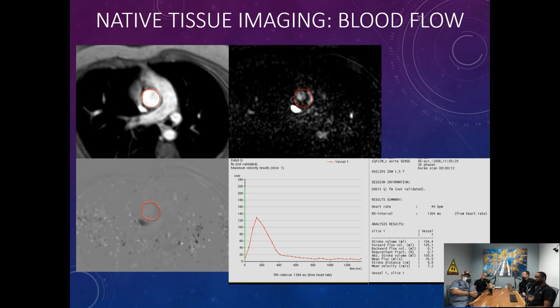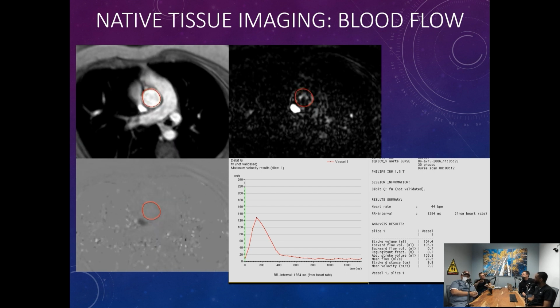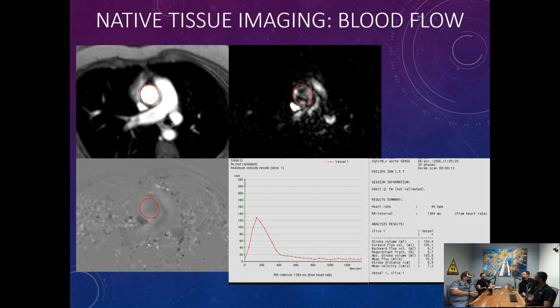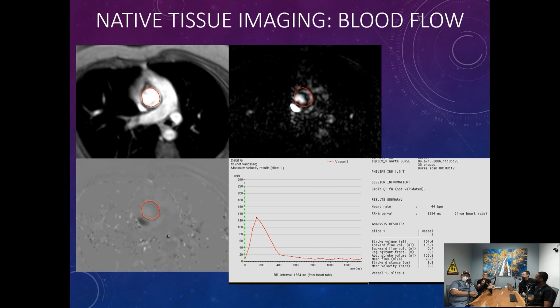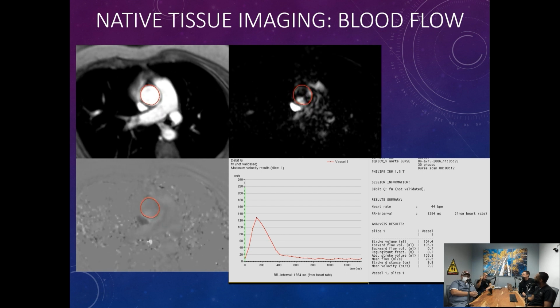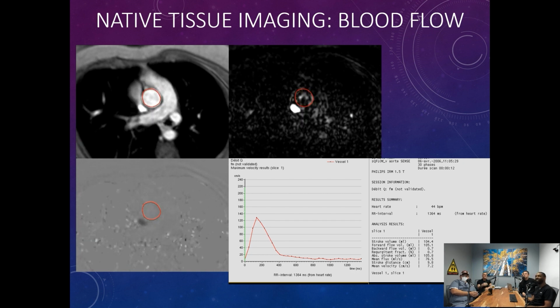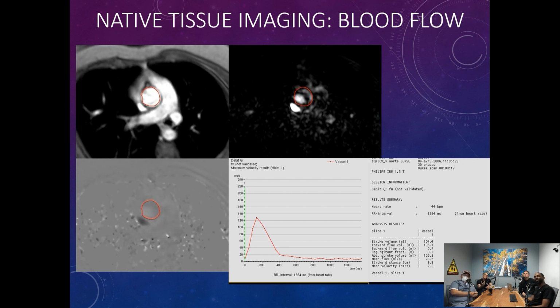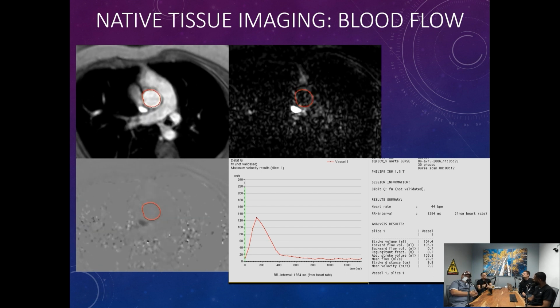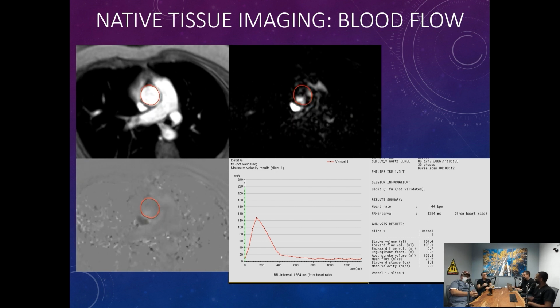In velocity mapping, what we do is we basically add a supplemental equal but opposite direction gradient that nullifies the signal of stationary tissue and highlights what moves in and out of the plane. So with blood imaging, we try to suppress the blood signal. With velocity mapping, we suppress everything else but what travels. And the way the sequence is engineered is that the amount of phase change is proportional to the velocity of flow, basically. So we can take an educated guess.